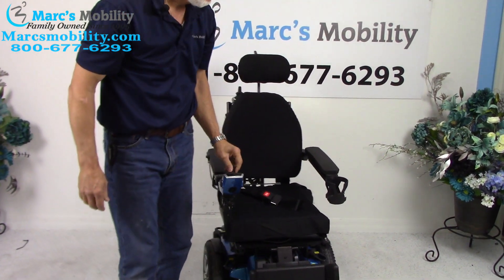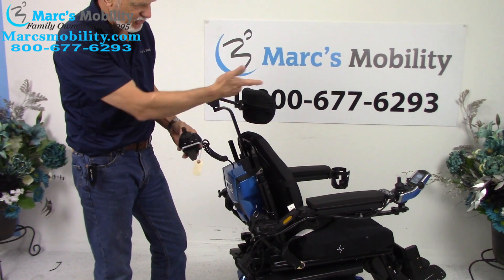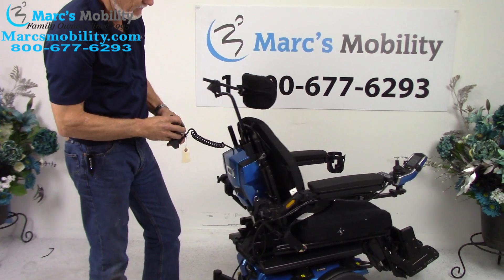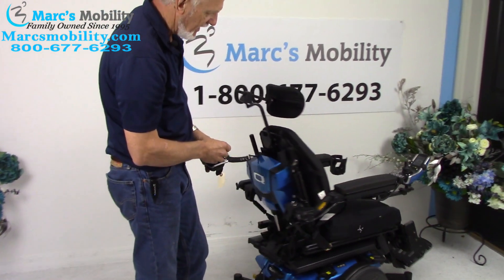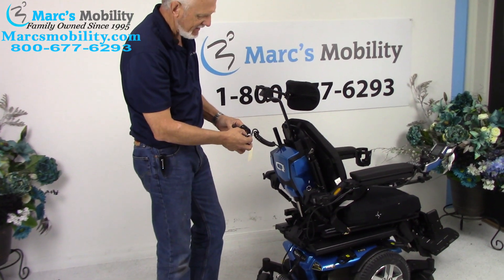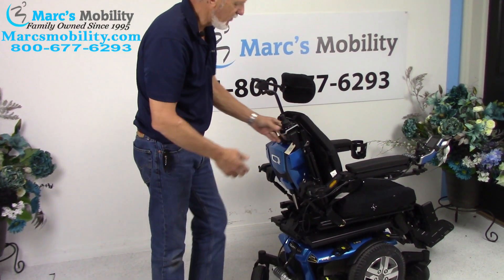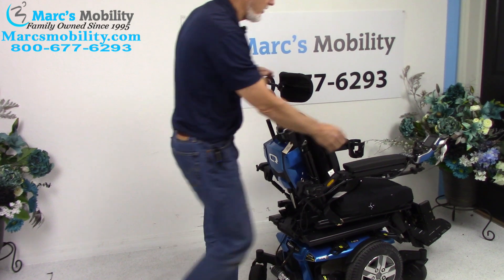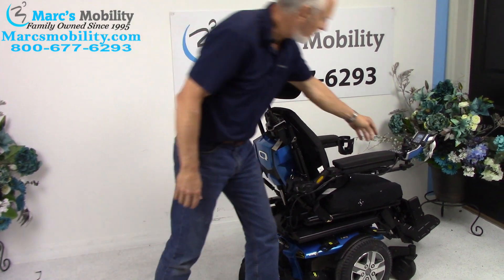On the back of the chair, you have what's called an attendant control. If I switch the control from the front to the back, I can drive the chair from back there and run all the functions — the tilt, everything. When you're done, make sure you switch it back to the front. Only one person can drive at a time: if you're driving from the back, the front joystick won't work, and vice versa. Then turn your power back on up front, because when you switch it from back to front, it turns off.